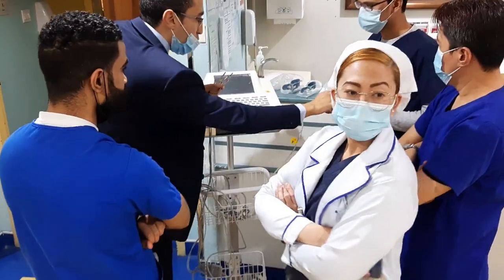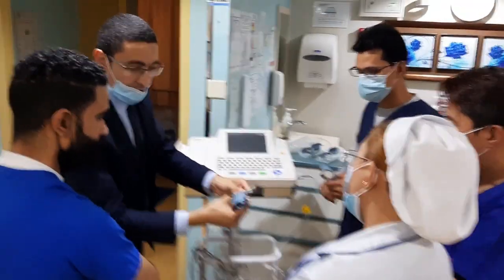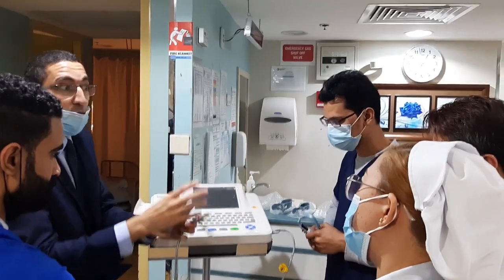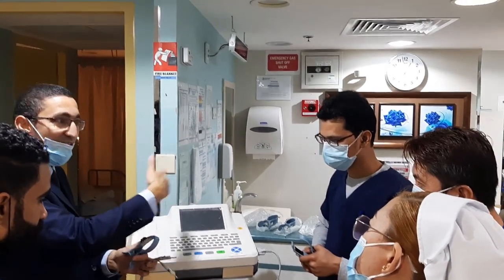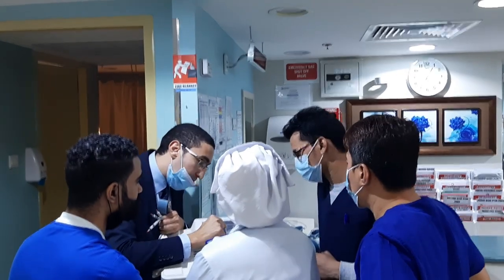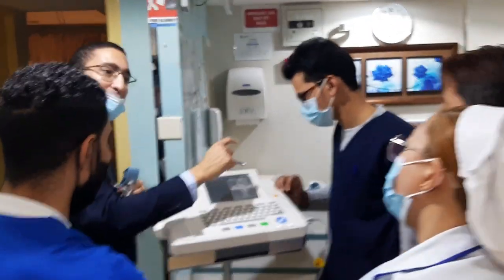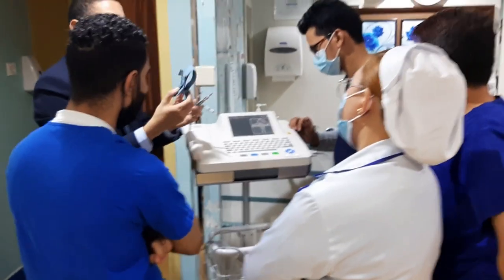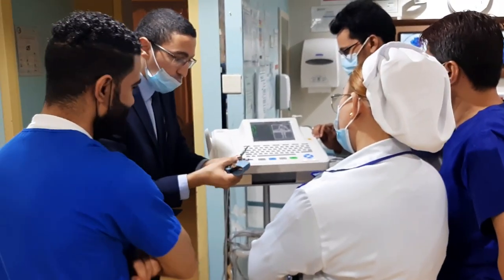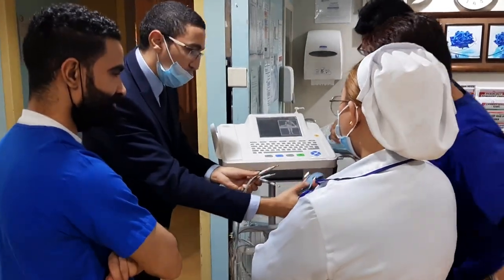Okay. So this one, the small one, you have R, N, L, and F. Maybe you are confused about what is R and what is L, because there is the British system and another system. So it's very easy here, you have guides, you can press here. R means R, L means L. F is for the limb system. You will see it from the image. So you will fix it here: R and L, right arm and left arm. You can help us with the fixation.